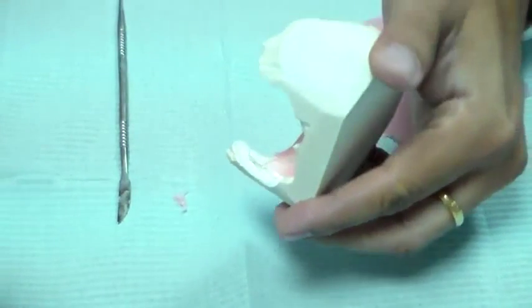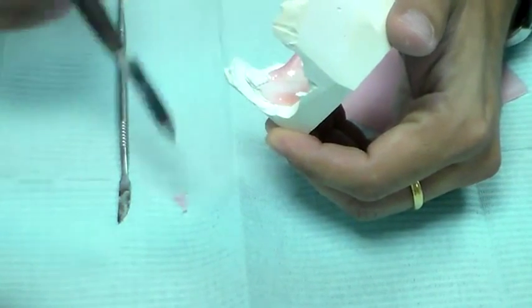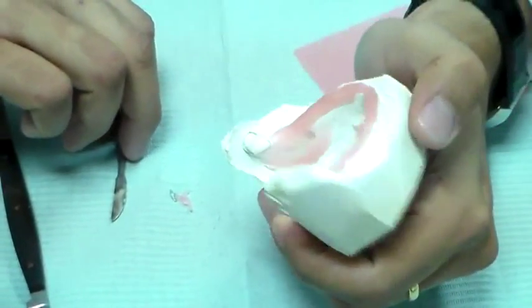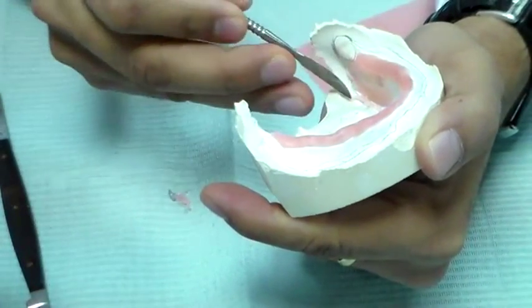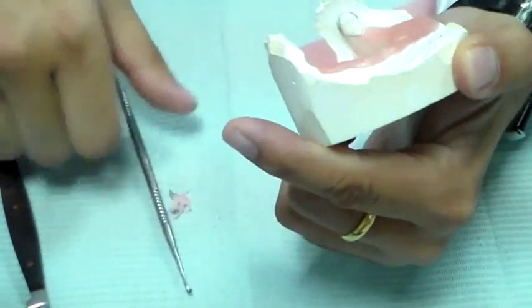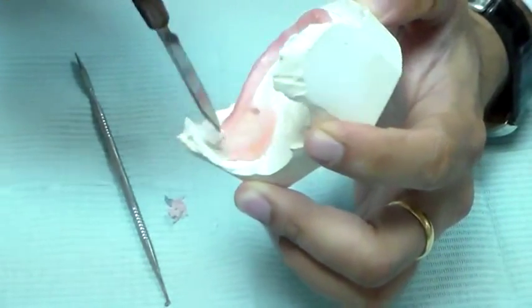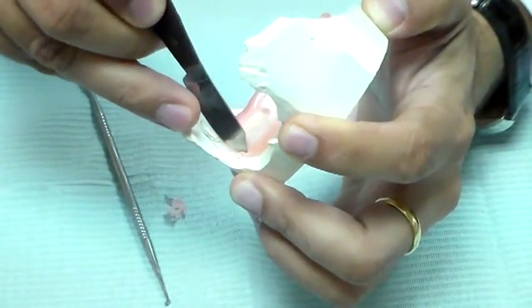You can see the amount of wax I have used — not much, just a little into that area. I just want it to be straight. I'm cutting off any excess and taking it off with a cold instrument, then adapting that.